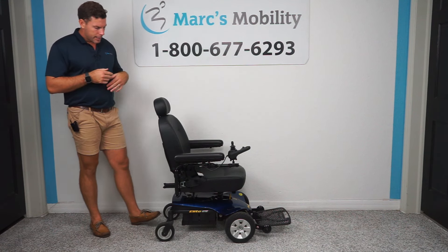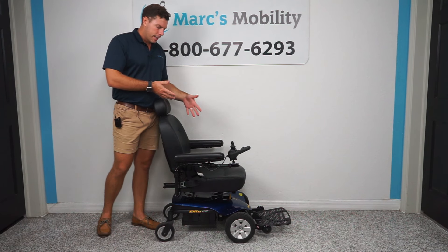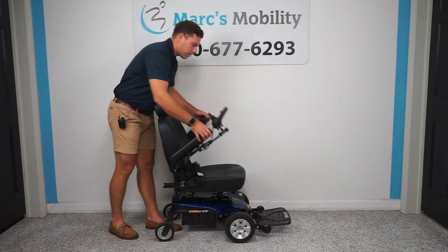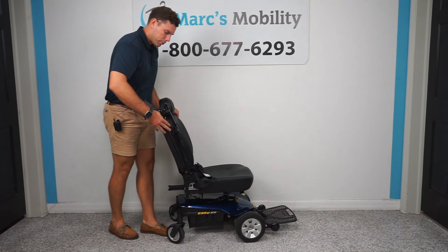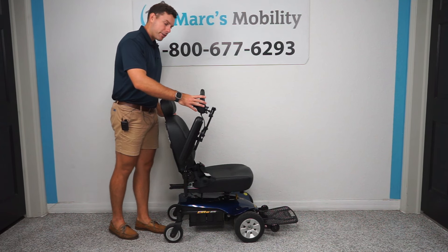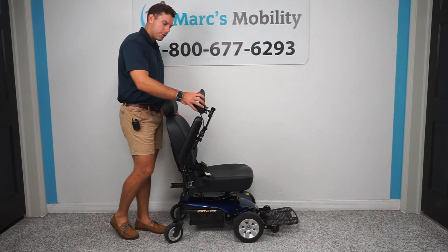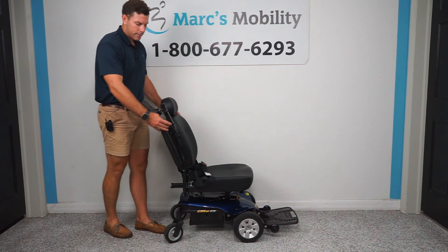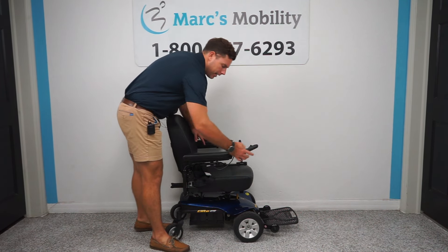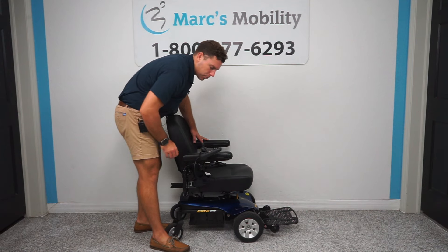This unit comes standard with an 18 by 18 inch seat. It has armrests that flip up on both sides for easy access. I always recommend turning the power off when getting in and out of a power chair so you don't accidentally hit the joystick.